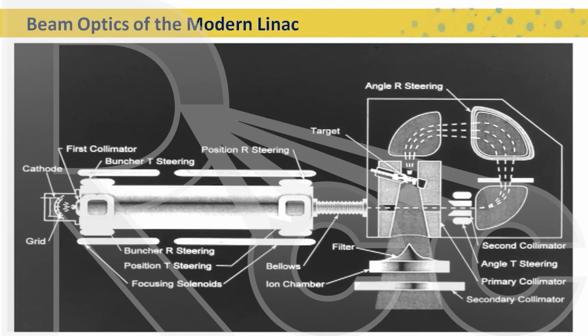In a Linac, if you're delivering dose in a matter of seconds, there's not going to be a lot of movement. In a Cobalt unit, if you're delivering treatments in the order of minutes, and it could be 5 minutes, 8 minutes, 10 minutes, there's going to be much more patient movement. So your immobilization has to be even better. I hope that answered that question.